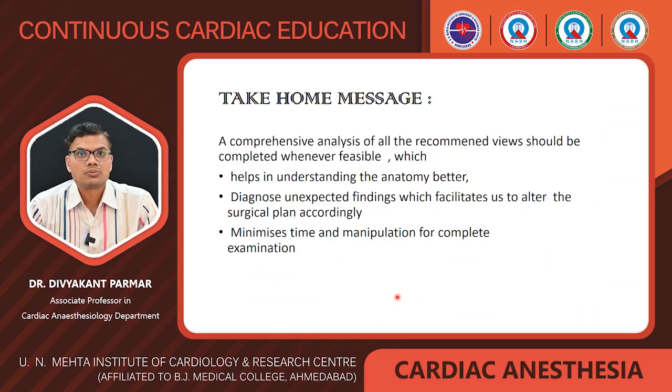So finally, to conclude my topic, this comprehensive analysis of all the recommended views should be completed whenever feasible, as it helps in understanding the anatomy better. It diagnoses unexpected findings, which facilitates us to alter the surgical plan accordingly. It minimizes the time and manipulation for complete examination.